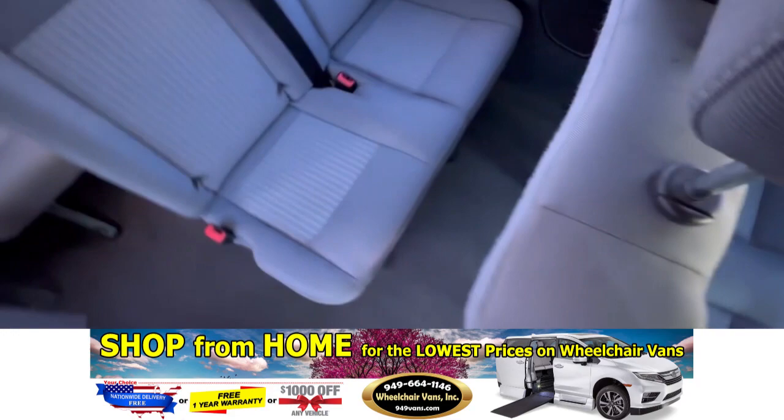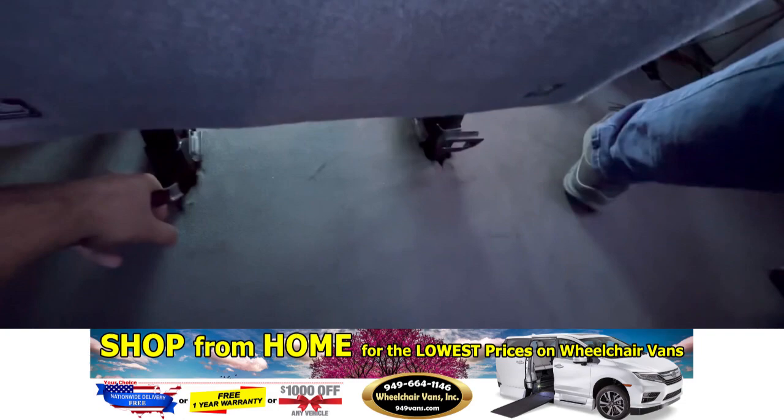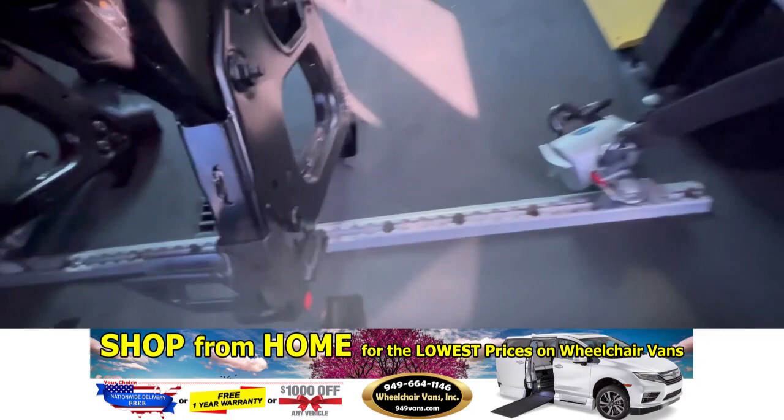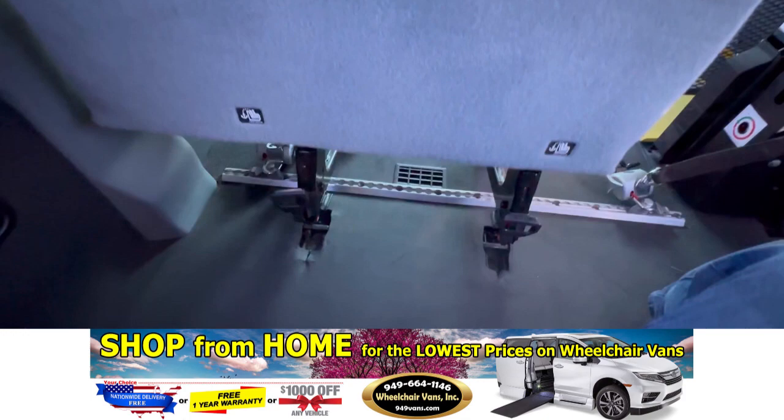If you need more room for a wheelchair, this bench seat here is also removable. Come back here to the two levers — pull here and pull here — and you can tilt up the seat. Once it's tilted up, slide it back and remove the whole seat out of the way. To put it back in, make sure the front is seated in first, then drop it down and it'll lock in.